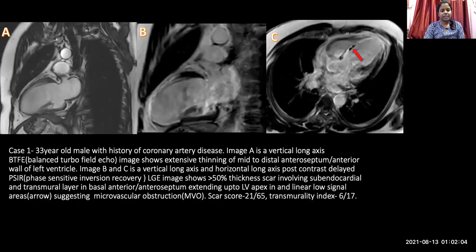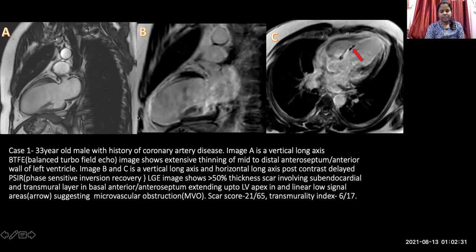The first case is a 33-year-old male with a history of coronary artery disease. Image A is the vertical long axis cine image of the balanced steady-state free echo, showing extensive thinning of the anterior wall of the ventricle extending from the mid to apex of the left ventricle. The post-contrast late gadolinium enhancement images show sub-endocardial to mid-myocardial scar from the mid to distal left ventricle, with a low-signal linear area in the left ventricular wall suggesting microvascular obstruction.